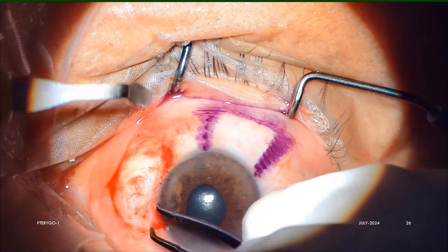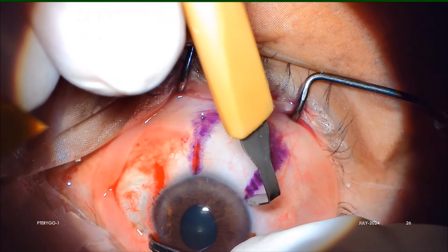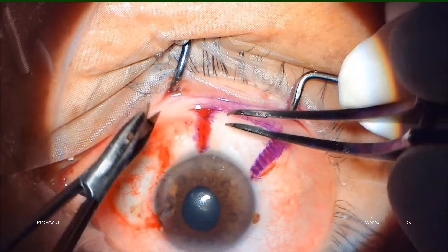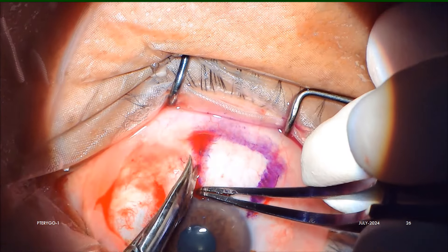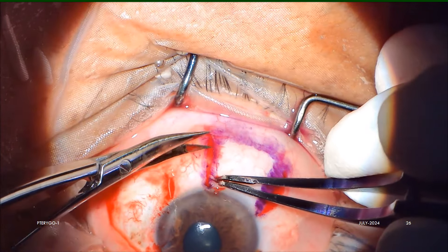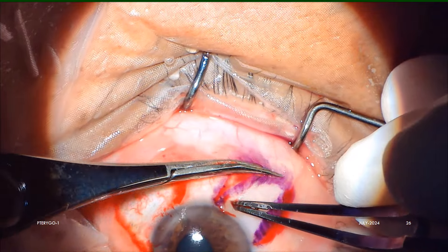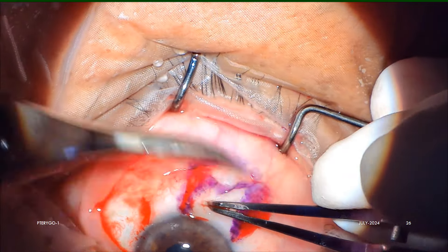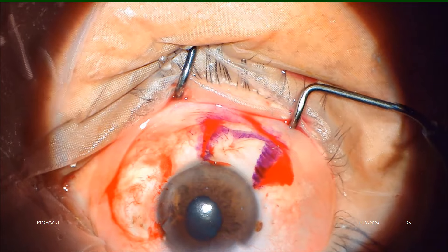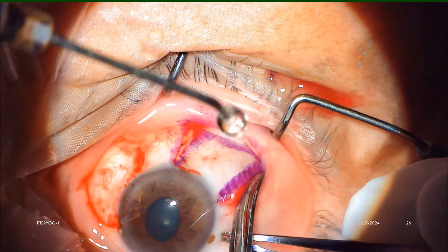We gently put two conjunctival scratch incisions with a crescent blade, using very little force, always avoiding any damage to the underlying sclera. The flap is then dissected with Westcott scissors. Care is always taken to harvest only the conjunctival flap, avoiding the Tenon capsule as much as possible, because we always want to avoid bare sclera at the donor site.